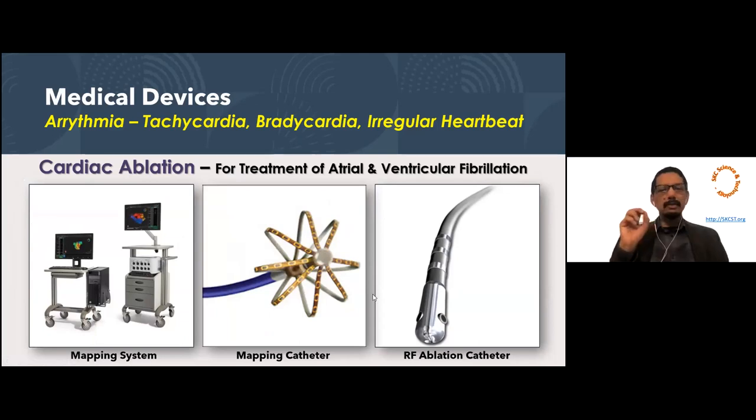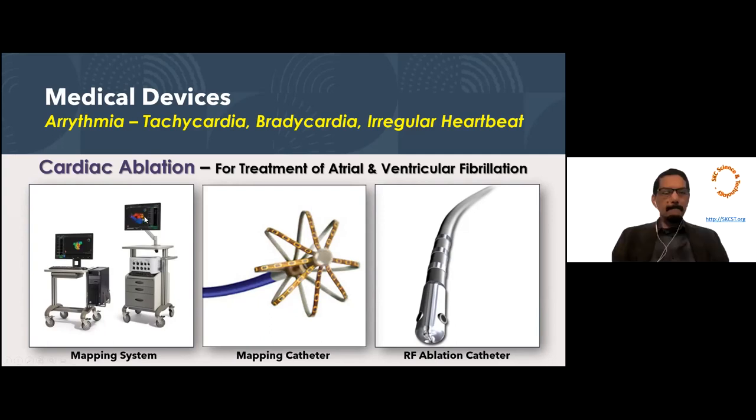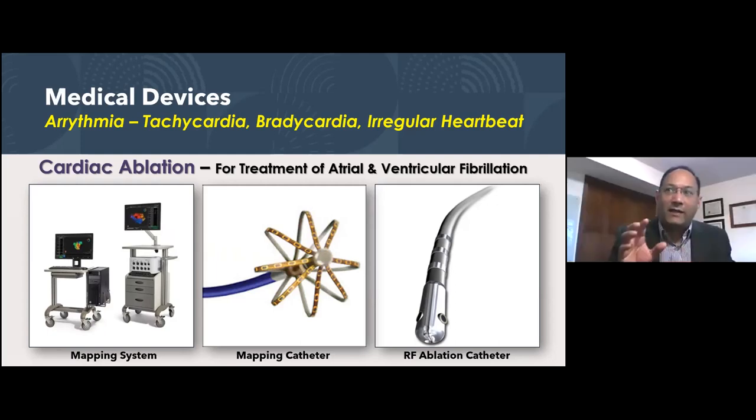So does it also take pictures as you go on and take a video yet, or not yet there? So there are cameras that are coming in with this. But right now, you can see this monitor here with an image. These are what is called magnetically loaded catheters. And there is another generator that can actually find out the location of this particular catheter inside the heart. And then they can recreate and visualize that on the screen. So very interesting. The physician actually knows where exactly the catheter is, what the shape is, and where the signals are coming from.